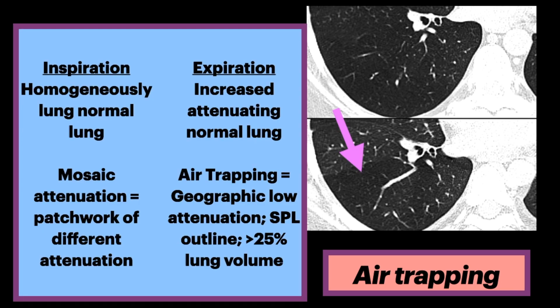On inspiration, the normal lung is homogeneously lucent. Mosaic attenuation is abnormal and defined as a patchwork of regions of different attenuation. On expiratory view, normal lung should demonstrate increased attenuation. The pathology of air trapping is sharply defined geographic foci of lower attenuation, which follows the outline of the secondary pulmonary lobule and affects more than 25% of lung volume.